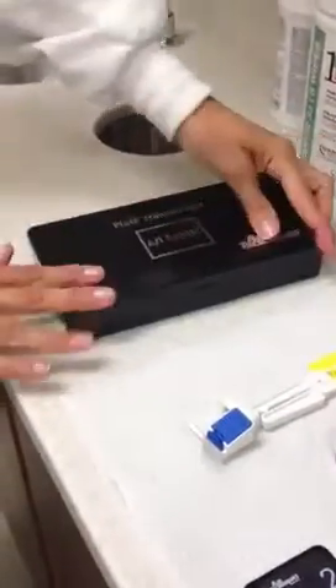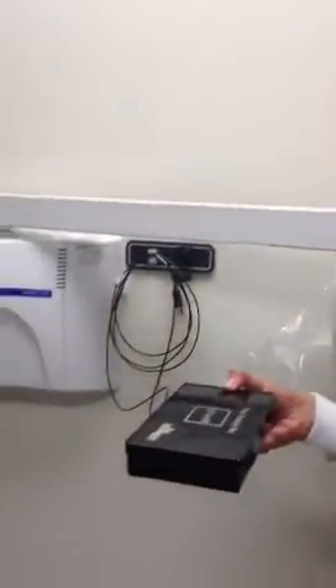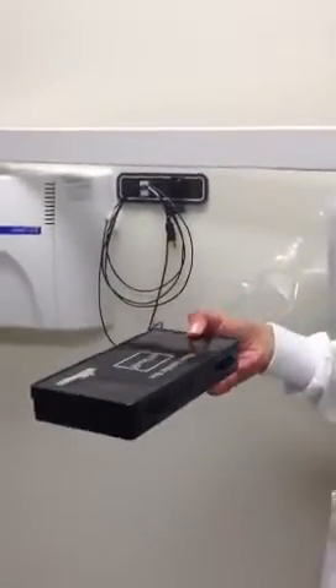Close the box and then transfer it to the Scanex machine. We could stop here and then we'll go through the Scanex.